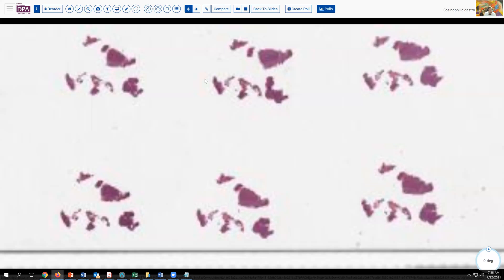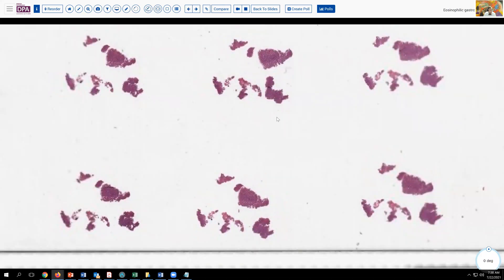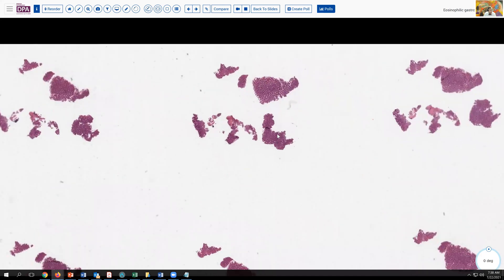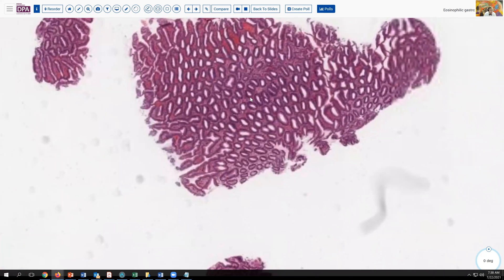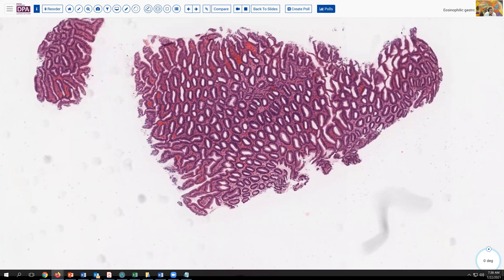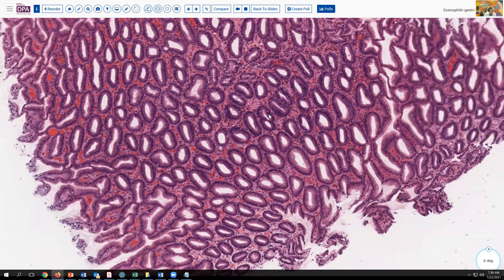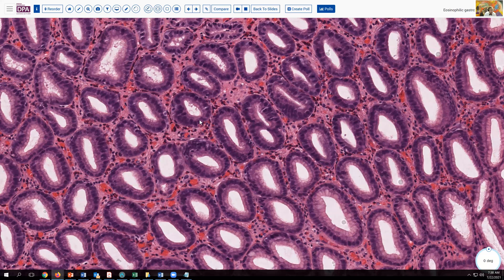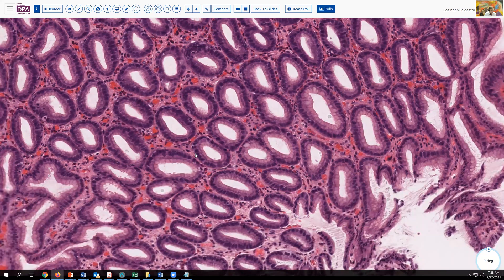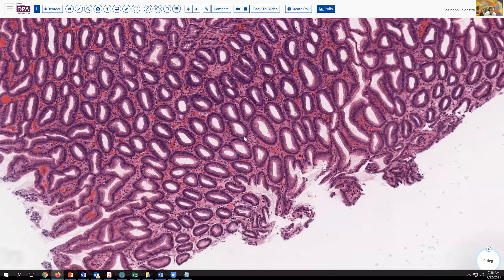Looking back at her biopsies again, this is one from the stomach. And again, we see in this situation a bit more eosinophilia to the tissue here. As we look on higher magnification, we see that the lamina propria is just quite packed with eosinophils. While you can see occasional rare eosinophils in the gastric mucosa, to see this number is very unusual and should raise consideration of eosinophilic disease.